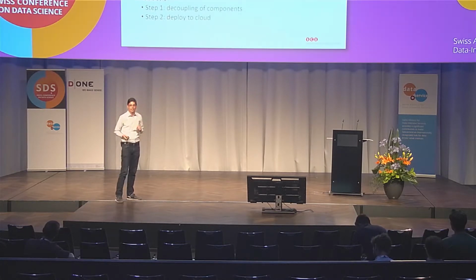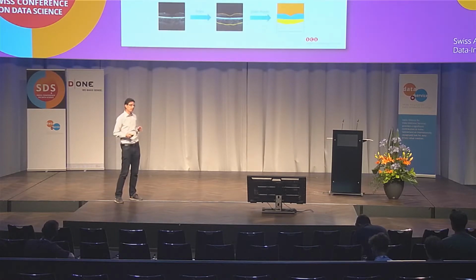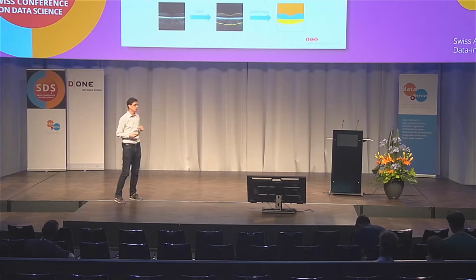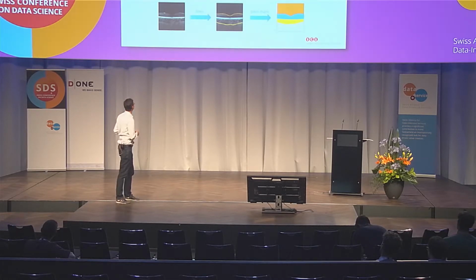Now next, let's talk about the ground truth. For our project, we had to generate the ground truth by ourselves. It was not there to start with. We had to generate labels somehow for our images. And first of all, we decided to work with 2D images. I mean, basically we had those 3D image stacks of OCT images, but we decided to work with 2D only to reduce the complexity of the task.